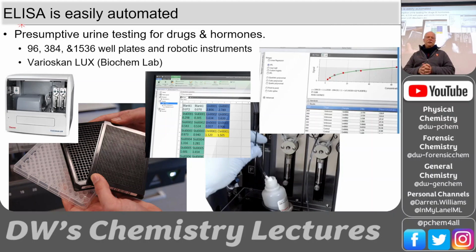Yeah. So you may be thinking, when would I be doing that for urine? Well, if you're working for the DEA or some company that does drug testing for companies, just 1,500 urine samples come in a day, and you set up the whole system, and it does the dosing and can tell, can read those things. Becomes robotic after that.